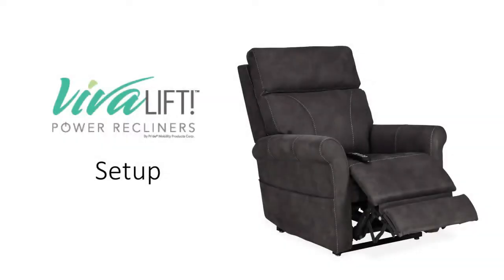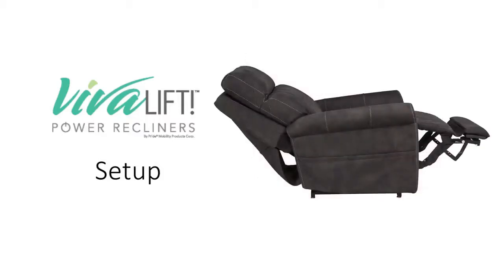The VivaLift Power Recliners bring a fresh new style and breakthrough technology by providing an infinitely flat mechanism with powered headrest and lumbar.